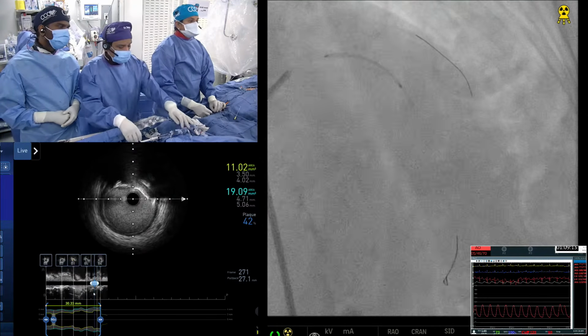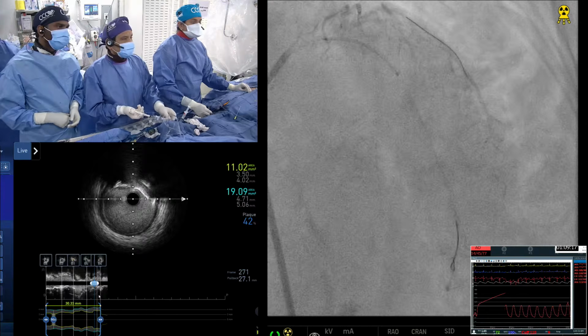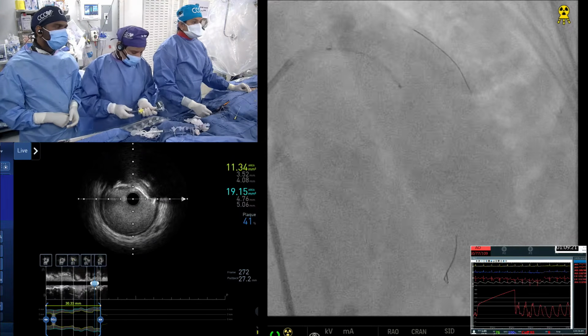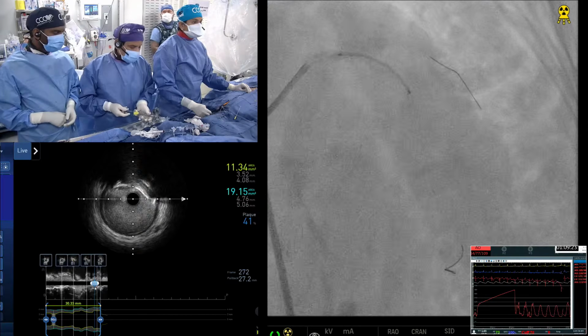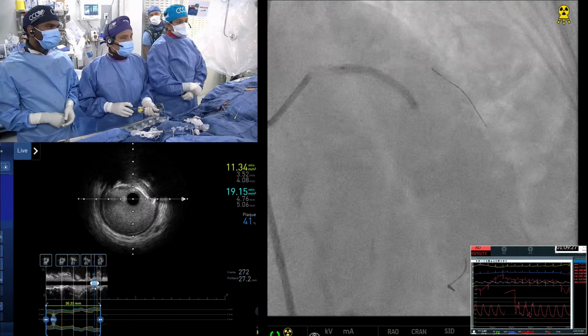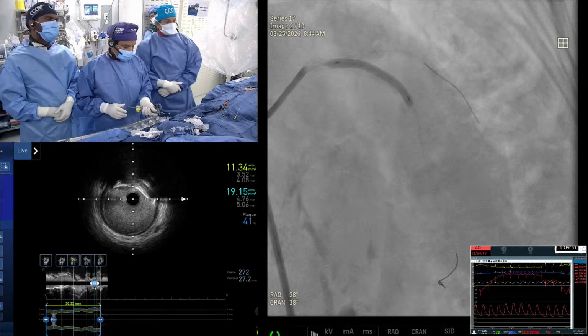I went in. Okay, now give dye. I think you should be able to cover it. Okay. Good. Looks good. Okay, go. So this is a 3.5 by 33, and low pressure because it is not. Yeah, so we are just going at 10 atmospheres. Yes. Okay. Down.